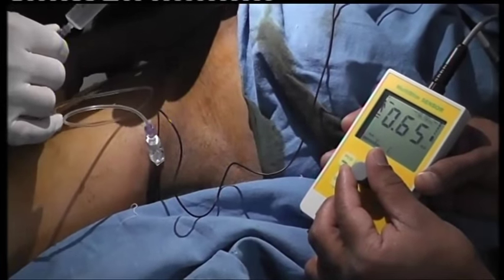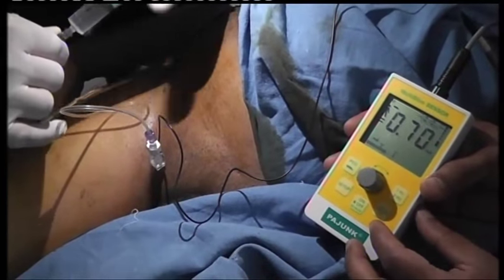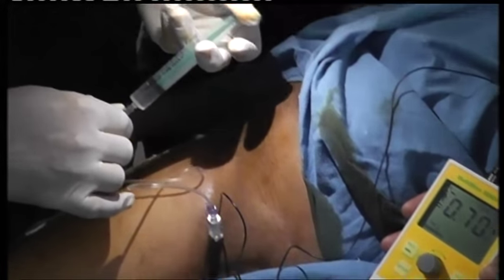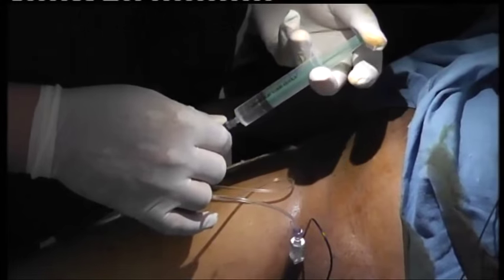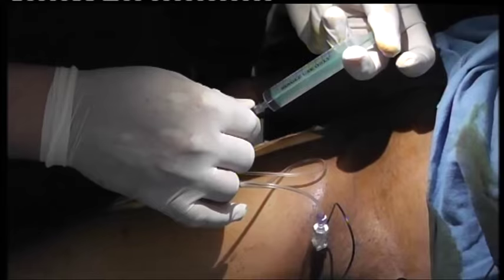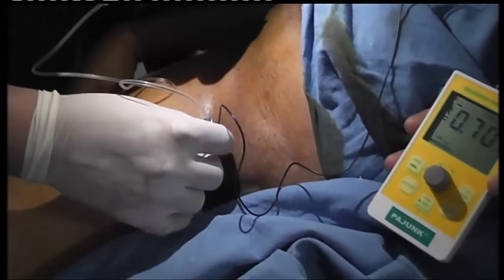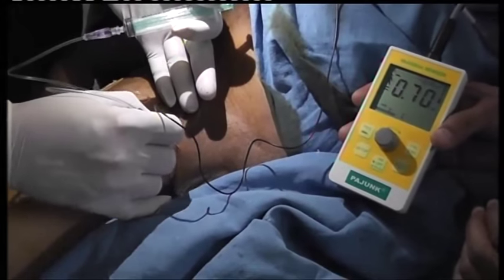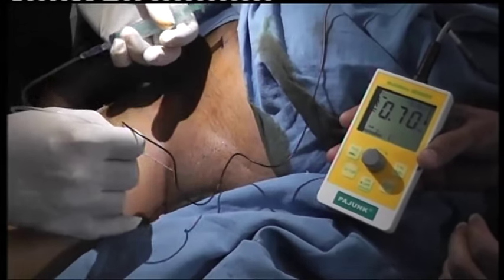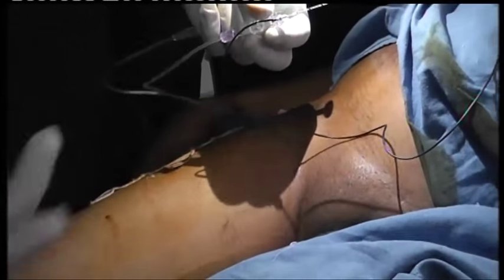Aspirate and inject 10 mls. This is a good block — obturator block — people can use it. We're not using ultrasound at this level, but if you are very proximal, you will have both nerves. These nerves can divide into anterior and posterior branches already at this level, but we were getting a good response from the adductors, so we assume it is both nerves.